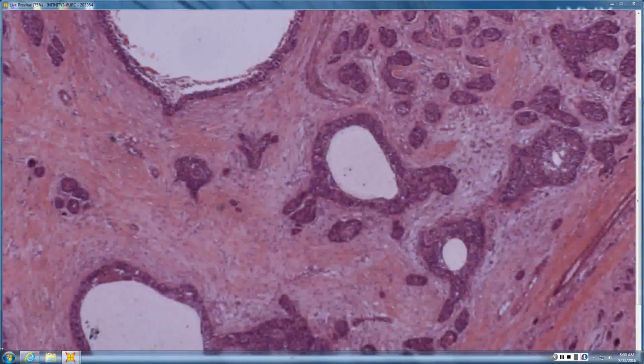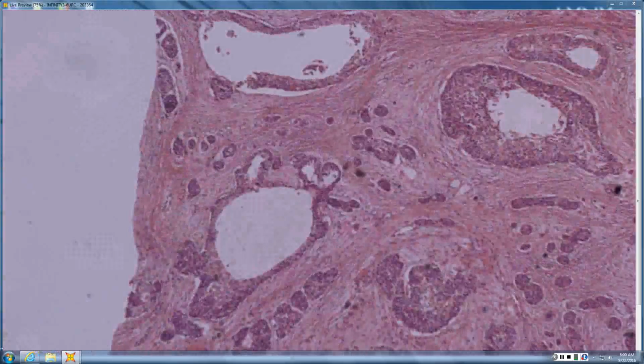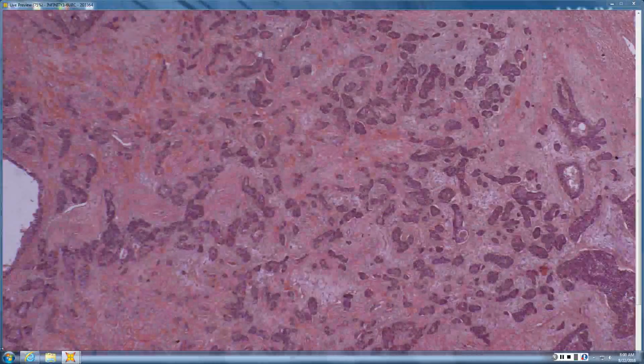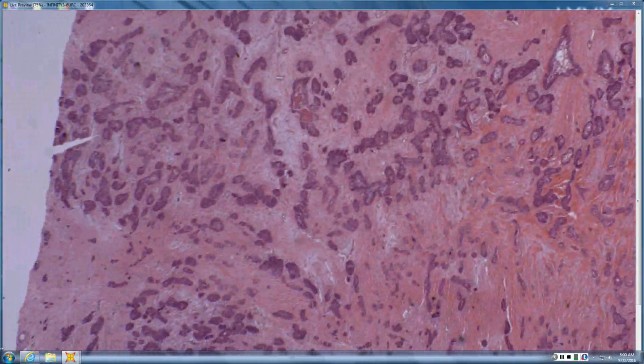This one looks sort of mixed. So some portions of it maybe suggest a mixed tumor. Does it appear to be well circumscribed, or does it appear to be invasive? Maybe invasive. Maybe more invasive. And has some large islands, small islands. It's certainly laying down a tumor stroma, which is partially myxoid.